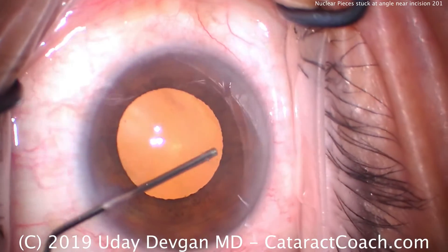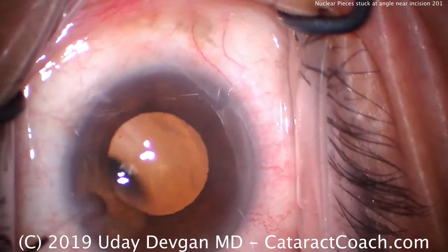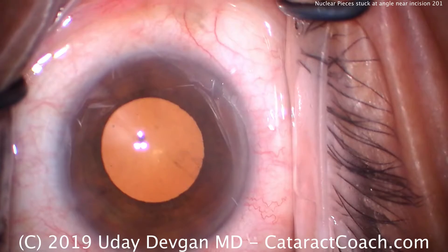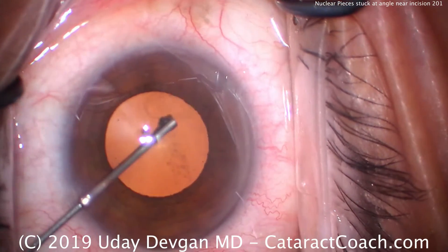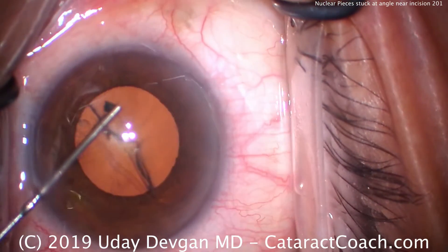CataractCoach.com, and our question today with this routine cataract case is: what do you do when you have a little piece of nucleus stuck at the angle of the eye, and you're trying to approach it in that sub-incisional area with the phaco probe? What's the safest and easiest way to access it?